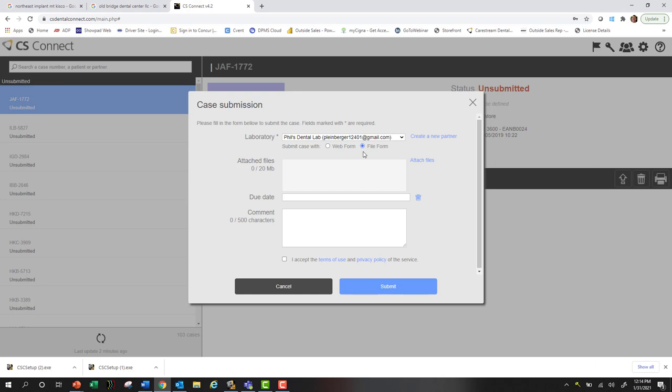If the lab you're sending to actually went into CS Connect and created a custom lab slip, then you can select web form and you'll see what they created as a lab slip. It's actually a little bit faster and easier just to do it from the file form, but you can talk to your lab about that.